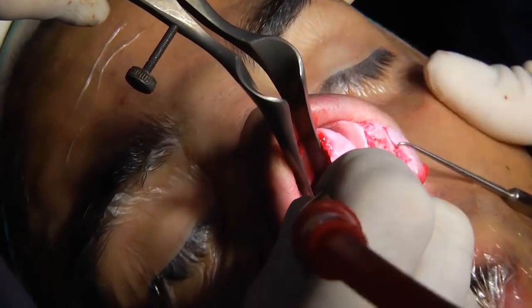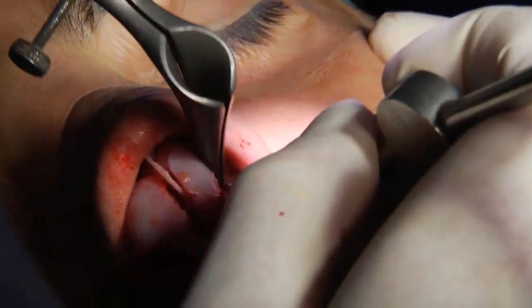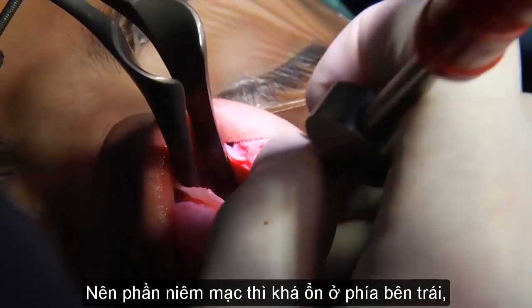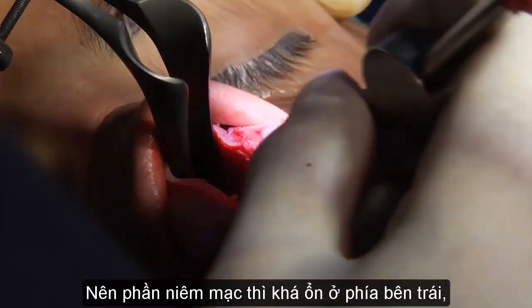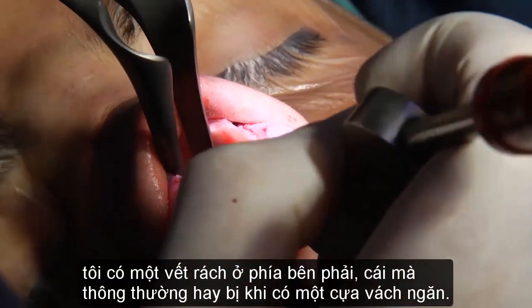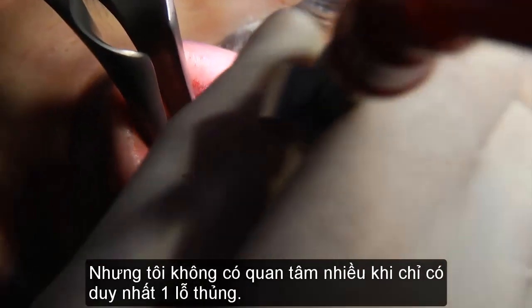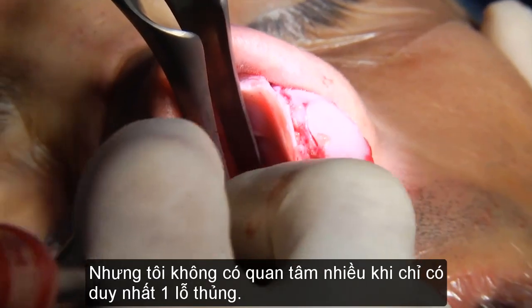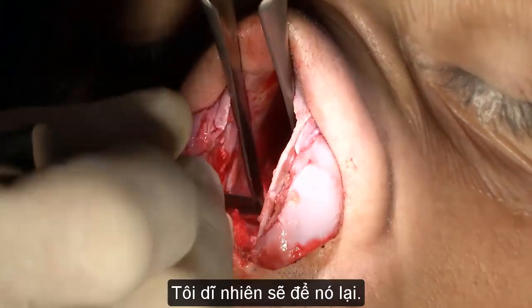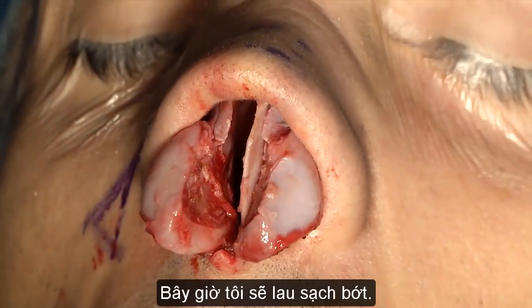Okay. And on the other side, let me check, but he didn't really have any major issue except the turbinates. So my mucosa is okay on the left. I have a laceration on the right, which often happens when there is a septal spur, but I don't really care, since one laceration without an opposing laceration, I will just leave it, of course. All right? Now I will clean.